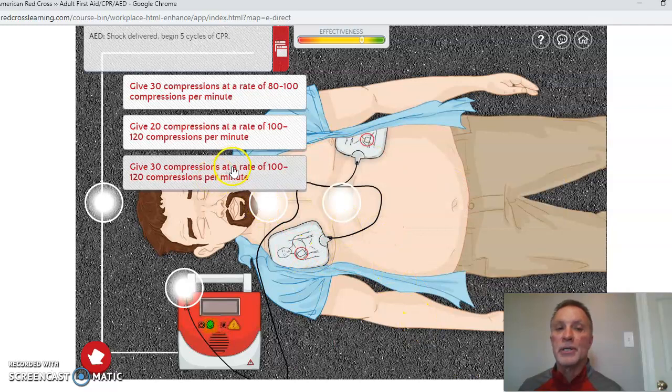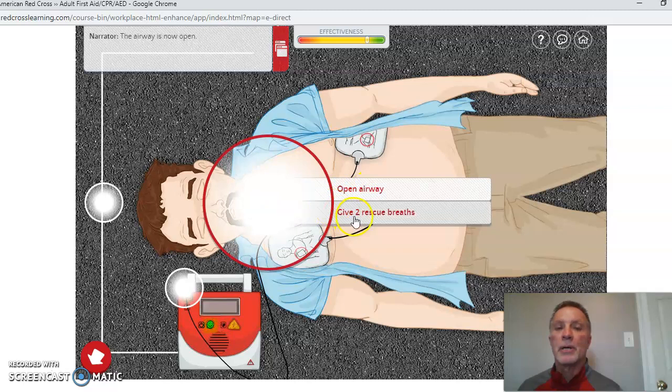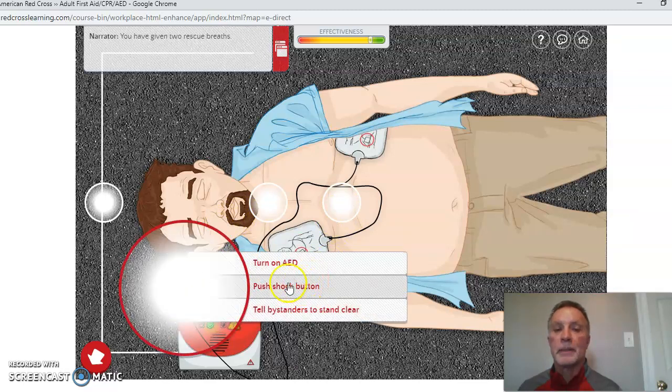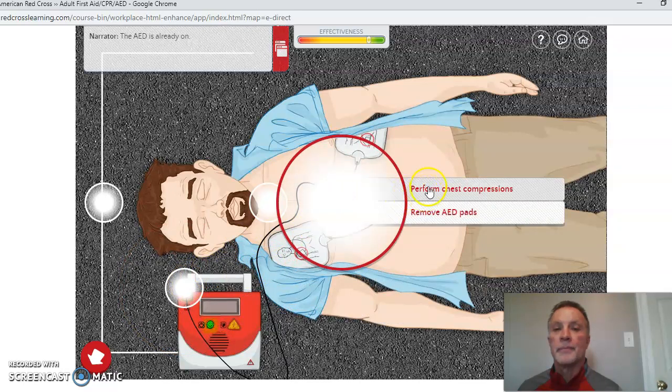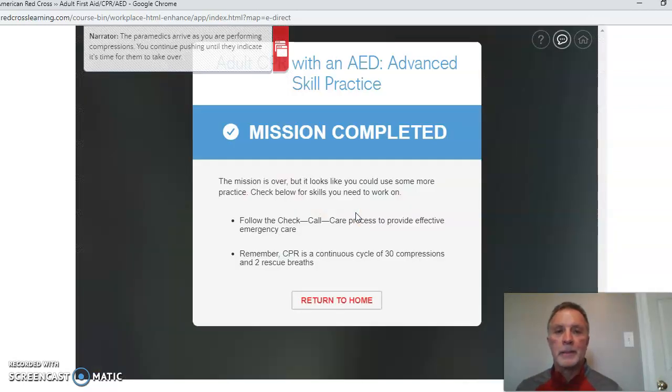Okay, you're going to give 30 compressions at a rate of 100 to 120 per minute. You've completed 30 compressions. Okay, we're going to open the airway. The airway is now open. Then we're going to give 2 rescue breaths. Okay, we continue that cycle. And so the AED is already on. The paramedics arrive as you are performing compressions. You continue pushing until they indicate it's time for them to take over.